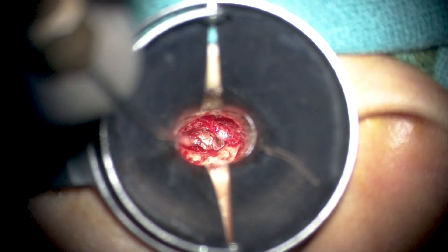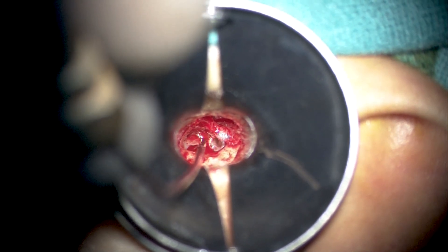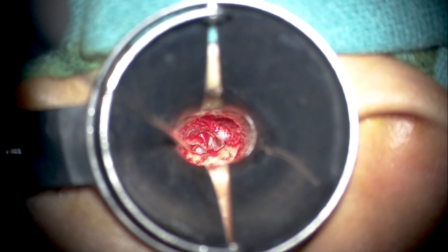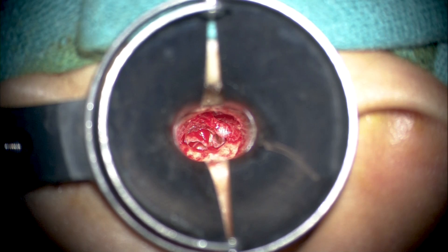Here, what we are doing is using a small microfine iris scissors to elevate and excise this pocket from the surface of the chorda, which is a safer way to preserve chorda function.